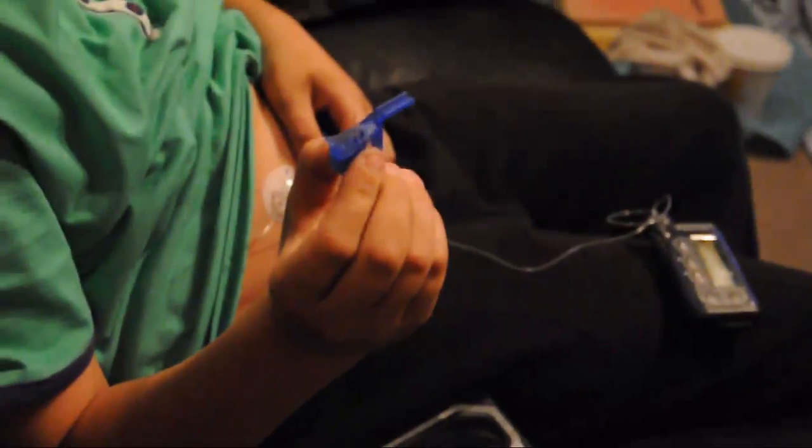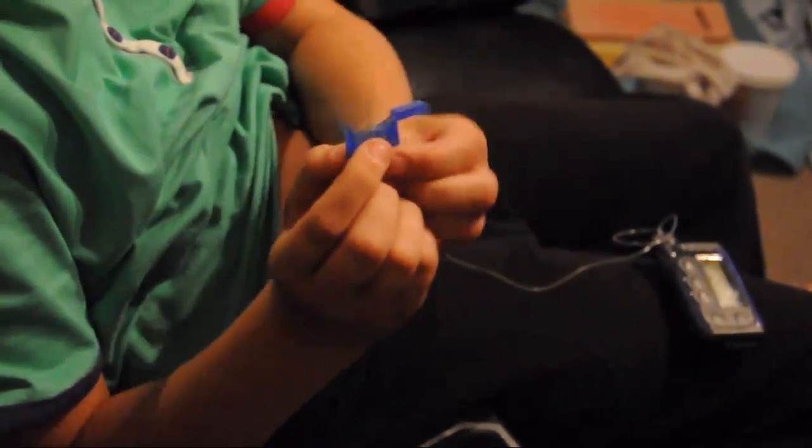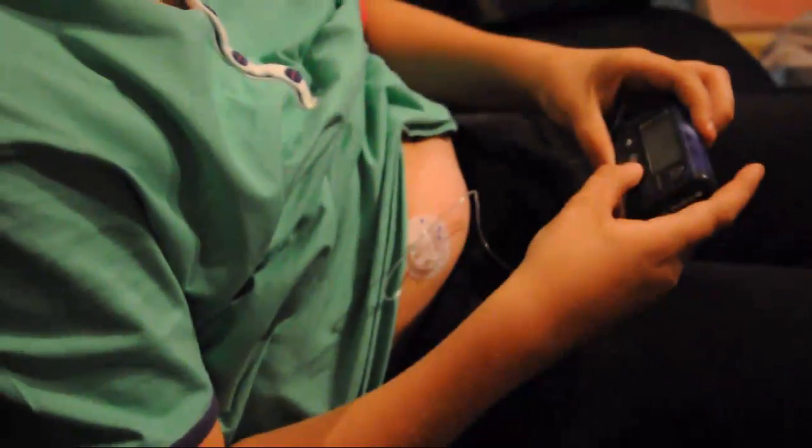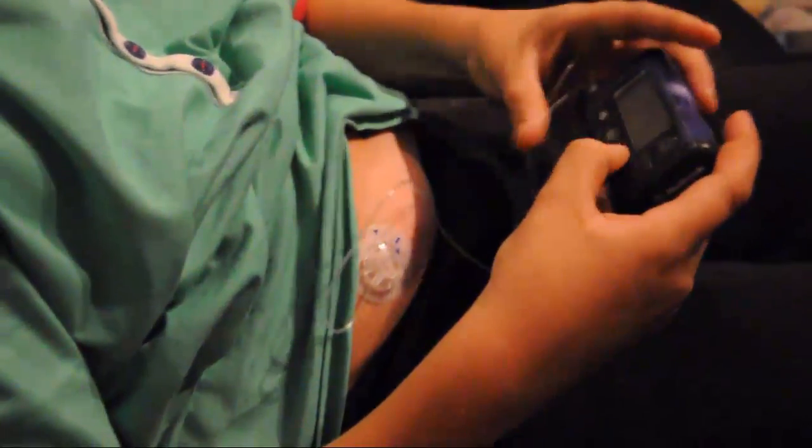And then that there is the needle that was used. And you just grab the end, push it over to make sure that the needle is safe and it's not going to hurt anyone. Then I have to go back to my pump and it will say act to fill.